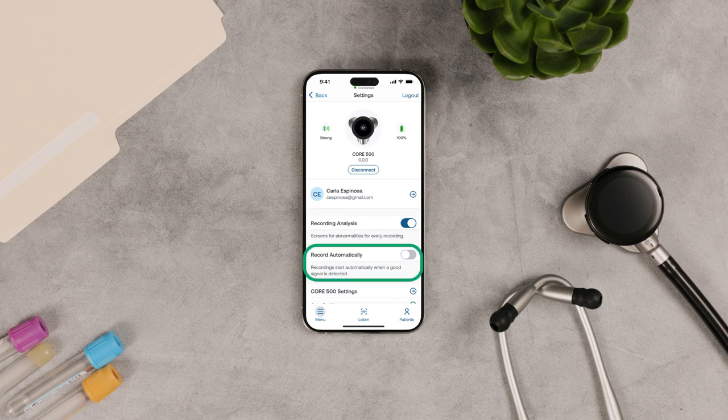Record Automatically means the recording starts automatically when the CORE 500 detects a good signal. Or you can start them manually.